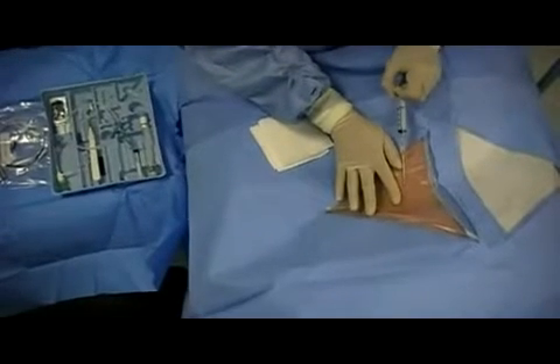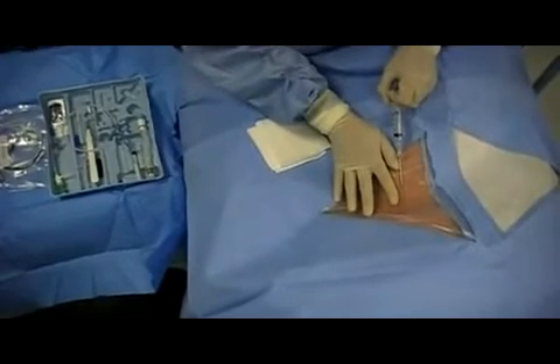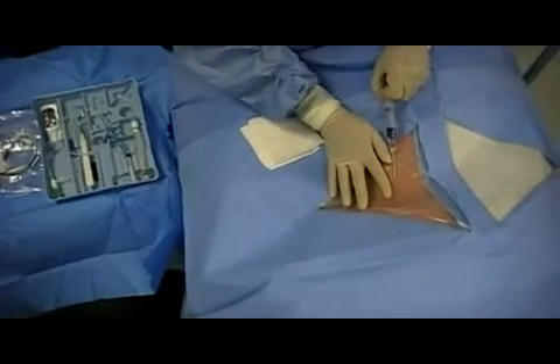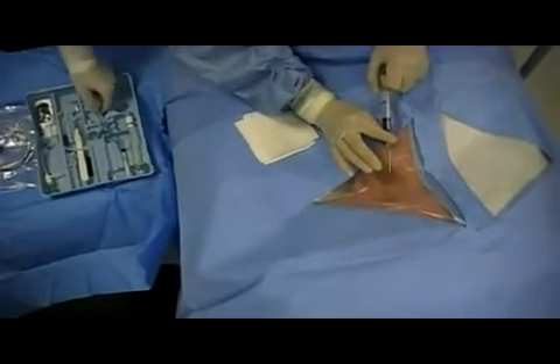Sterile drapes expose only the cleansed potential insertion site. Ultrasound guidance should be used to gain access; we omit it here simply to provide the learner with a better view.